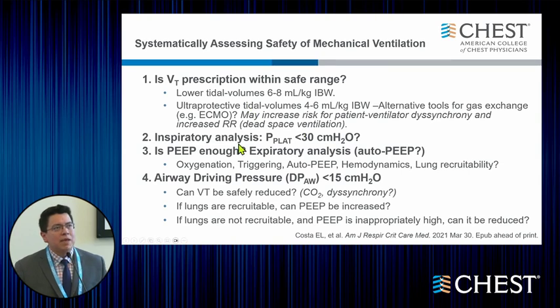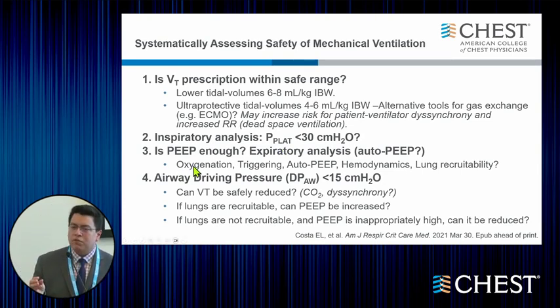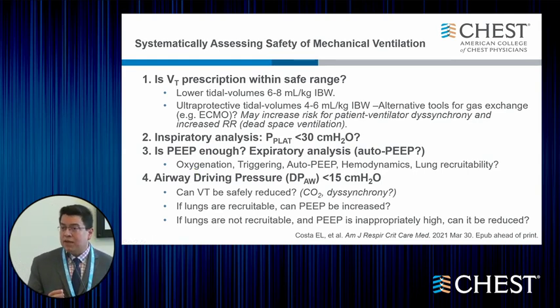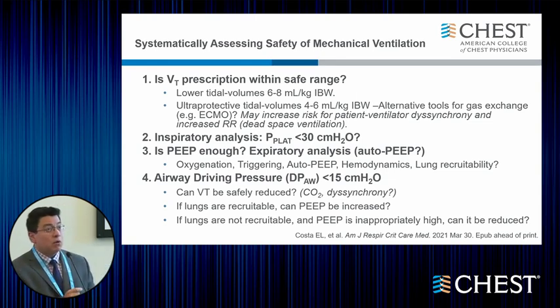Then we perform an inspiratory analysis, asking whether the plateau pressure is within a safe range, less than 30 centimeters of water. Then we look at oxygenation, the triggering of the patient, the presence of auto-PEEP, and also hemodynamic effects of your mechanical ventilation strategy to determine if your PEEP is adequate or not.